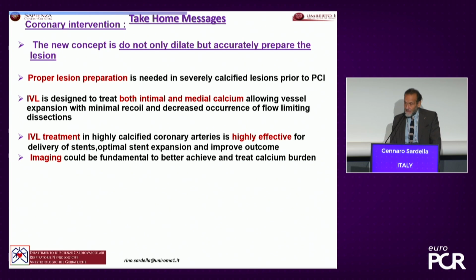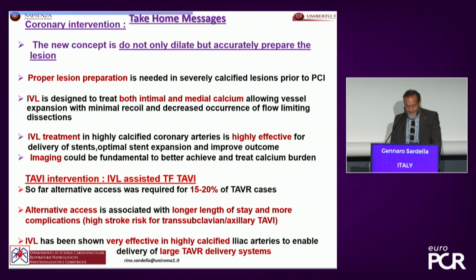And imaging is very important; it could be fundamental to better achieve and treat calcium burden. In the TAVI field, Professor De Backer showed us how important shockwave is.